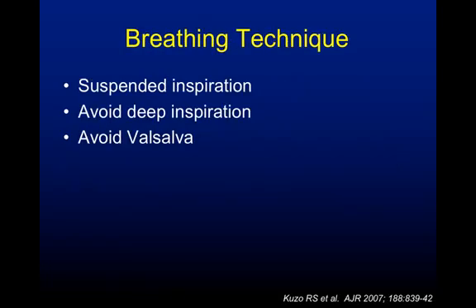You should instruct your technologist to coach your patient concerning breathing technique. The patient should be instructed to suspend inspiration and to avoid a deep inspiration, and especially avoid a Valsalva maneuver. This will ensure that you have homogeneous opacification of the pulmonary arteries.